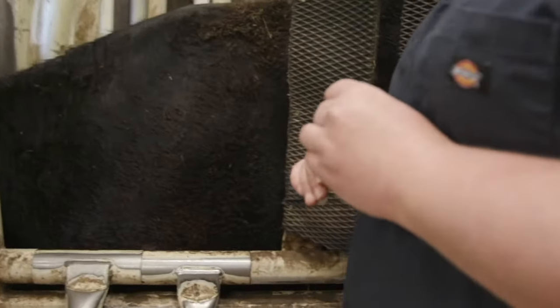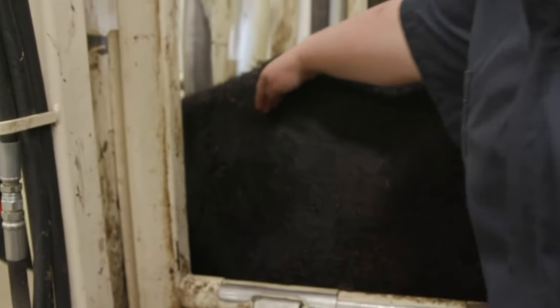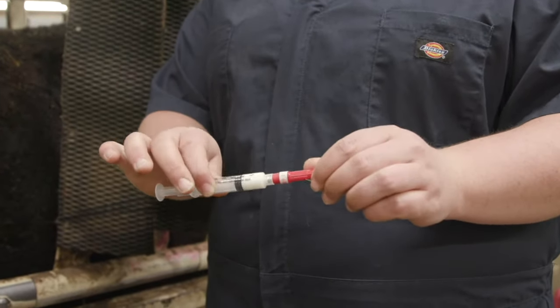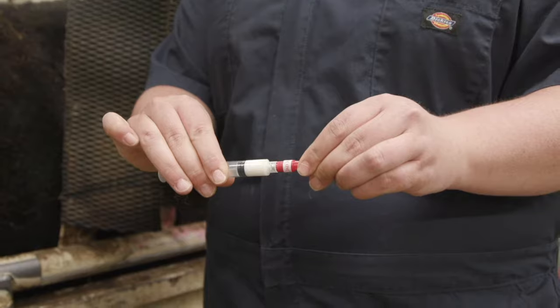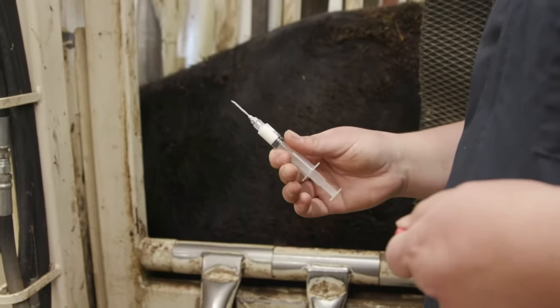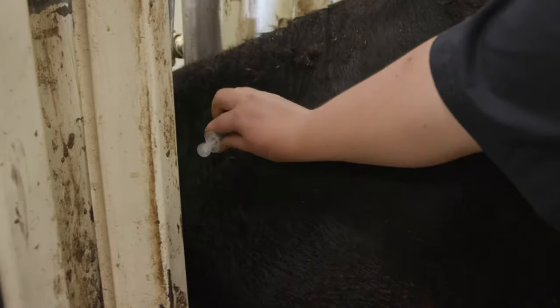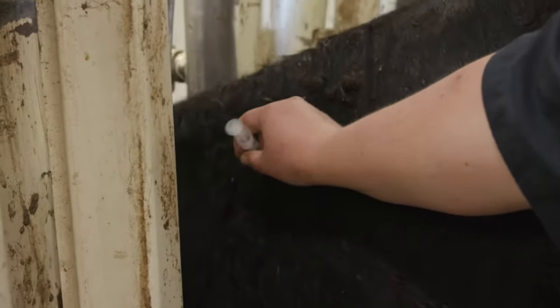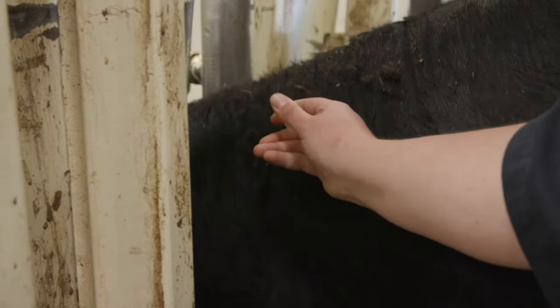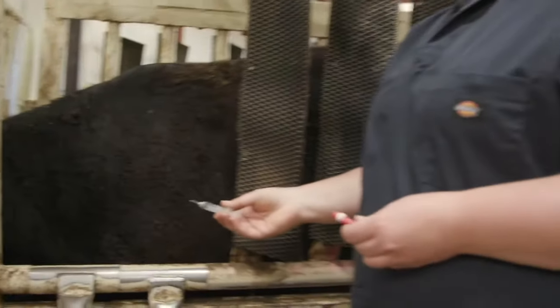When we go to give our injection, we're going to recheck our landmarks — shoulder blade, spine, ligaments — so we're going to be aiming right in here. When you're ready to give your injection using a single-dose needle syringe, you're going to uncap your needle, being conscientious of where your needle is pointing because you don't want to accidentally inject into yourself or any coworkers. Come forward looking at your landmarks again, and go ahead — quick stab in. Their hide can be tight. You want to be perpendicular to the skin and go straight in to the full length of your needle.